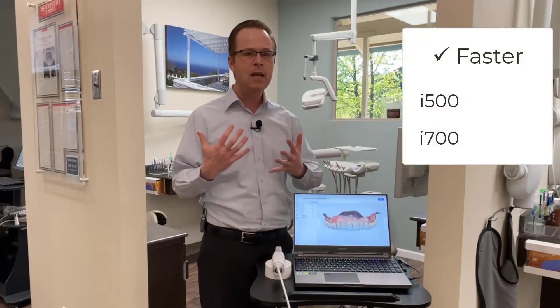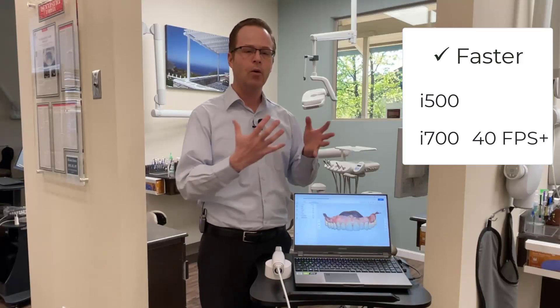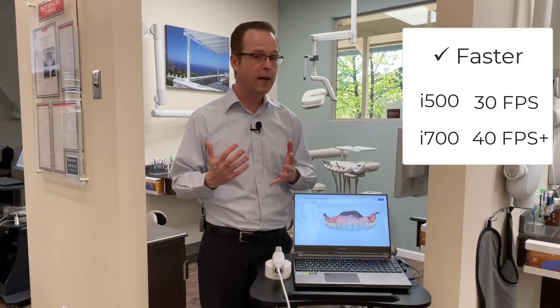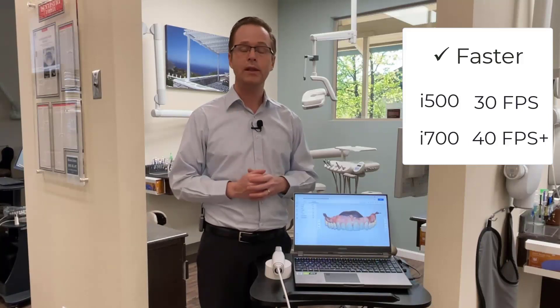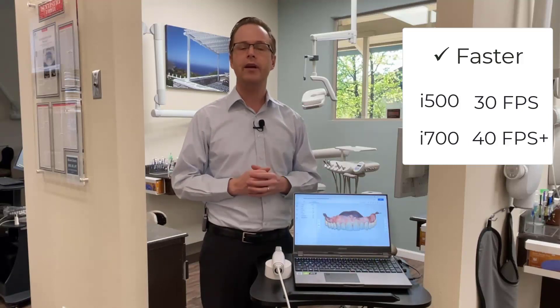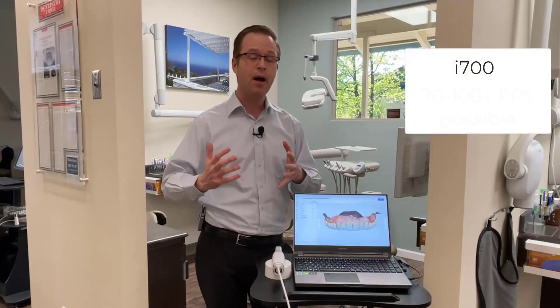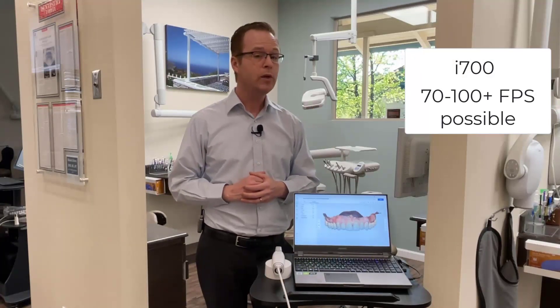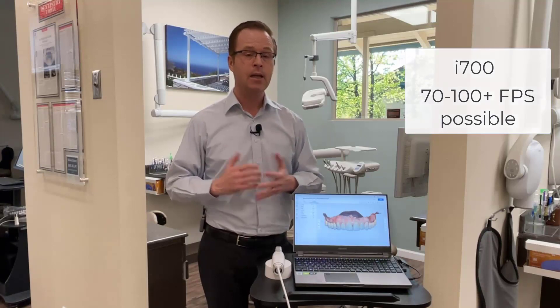In addition, it's much faster. According to team Medit, it's a minimum of 40 frames per second, where the scanning frame rate for the i500 is a minimum of 30 frames per second. So already quite a bit faster. But what they're saying is that it can be even faster — potentially 70, possibly upwards of beyond 100 frames per second, which means faster scanning.